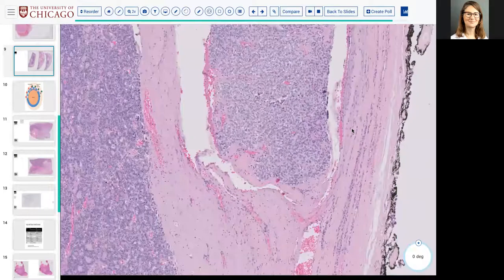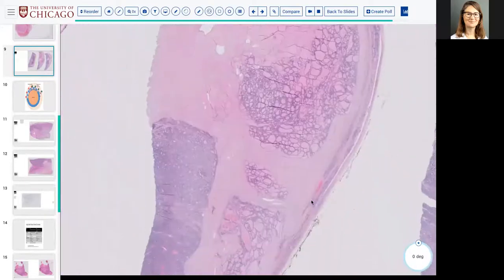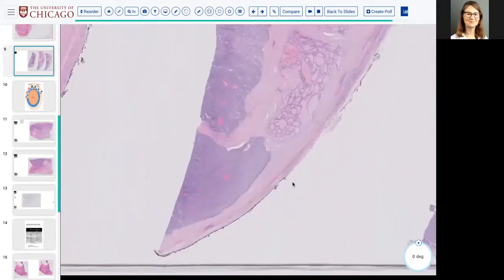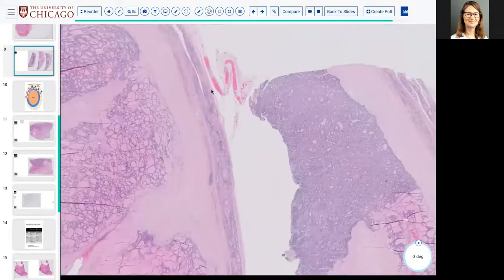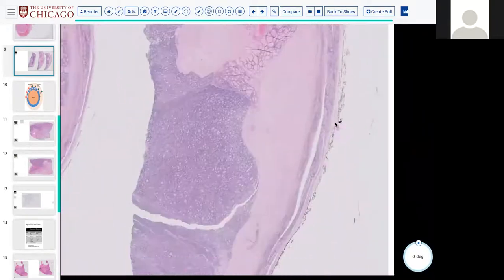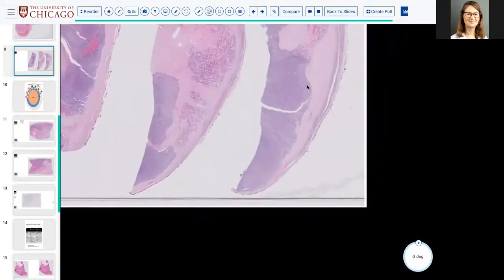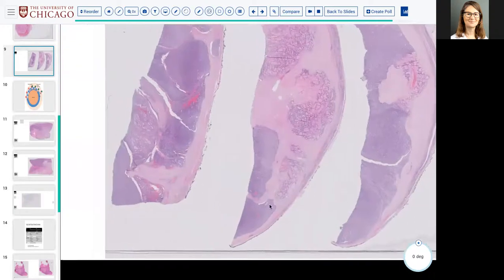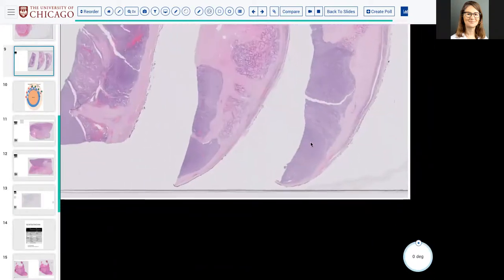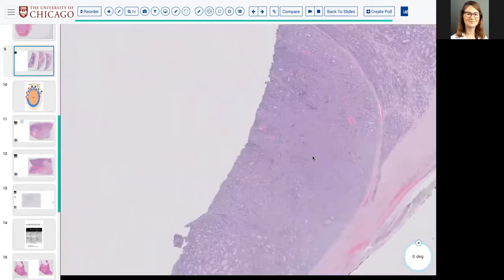And some of you who are saying follicular carcinoma, yeah, I think that's the diagnosis here. And so now, is this minimally invasive, widely invasive, or angioinvasive? At least angioinvasive. We thought too. Angioinvasive, exactly. So based on these three sections, there's nothing else. But you certainly would want to go and evaluate this thyroid thoroughly.